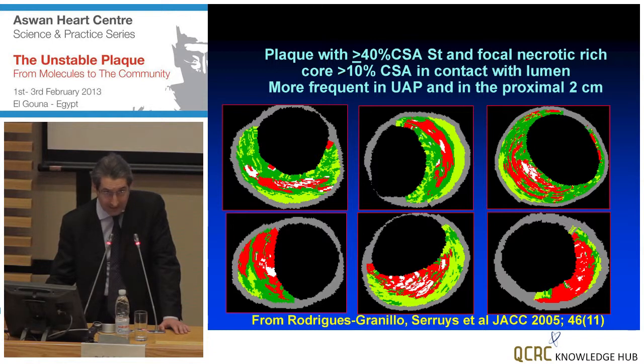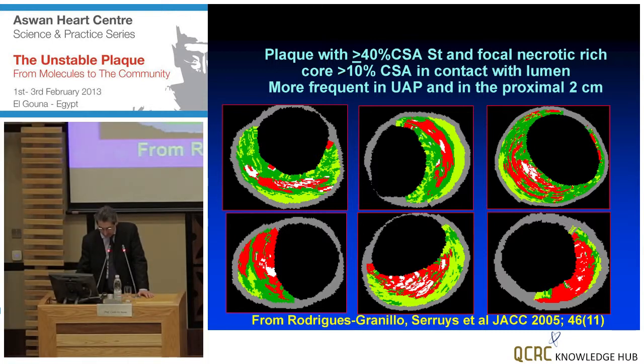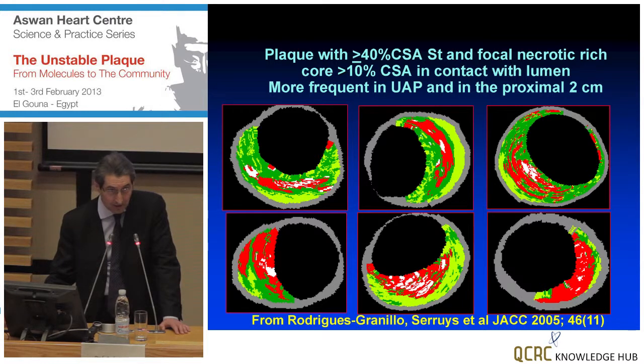also related to the relative limitation of the technique we use. We use mainly virtual histology, which is somehow not totally proven for the ability to assess the characteristics of the tissue, but also intravascular ultrasound in general is unable to measure the thickness of the cap. So the assumption to call a plaque vulnerable is that when you don't have anything visible between the lipid-laden plaque and the lumen, this is a thin-cap fibroatheroma, being 100 micron the resolution of intravascular ultrasound, and being 60 the cutoff criteria for thin-cap fibroatheroma.